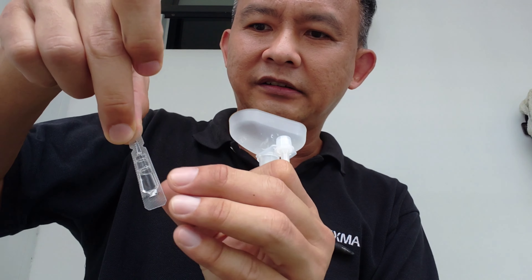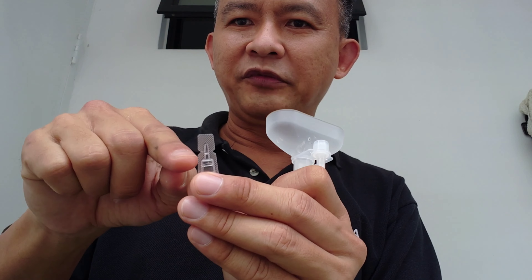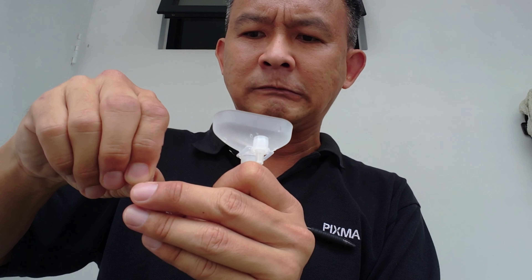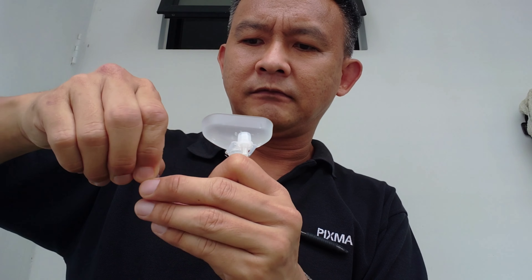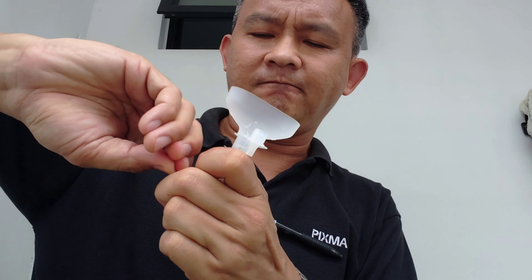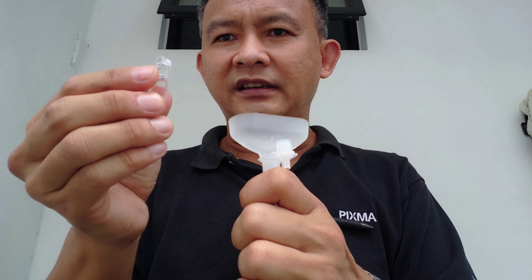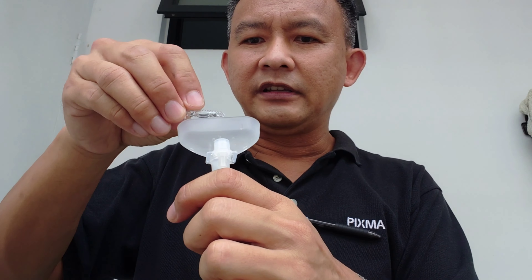Turning it upside down, and you break the part with the notch here — let's break it off like that. And then you place the entire buffer into the container.